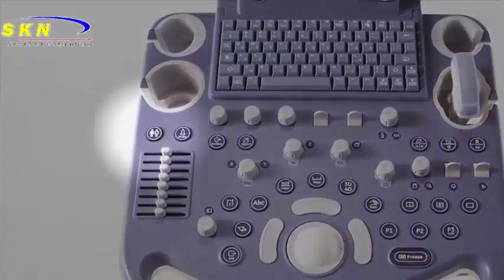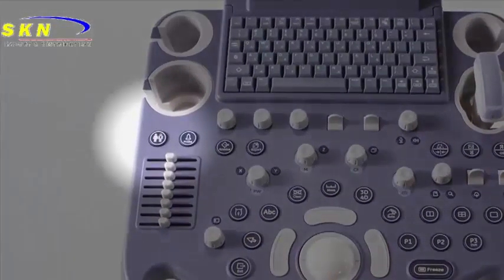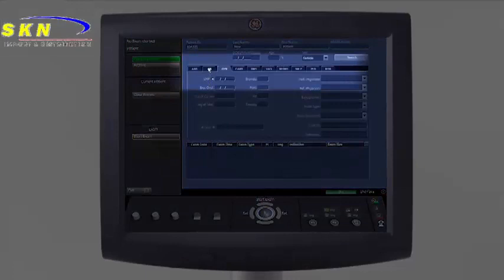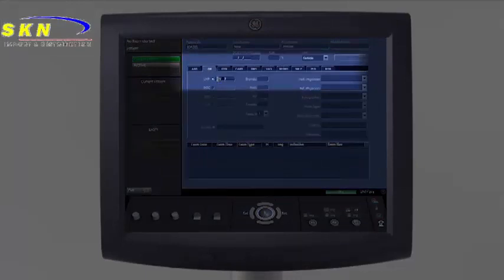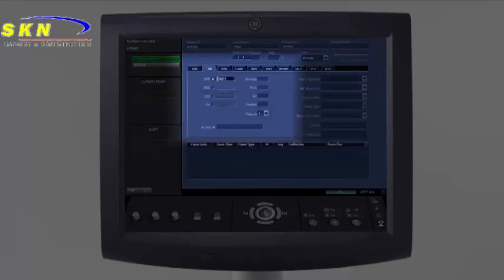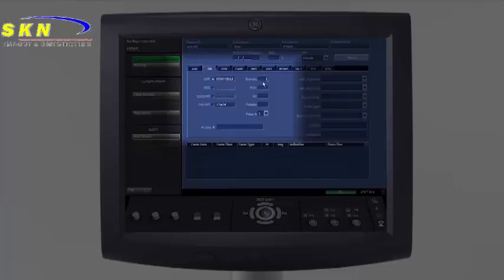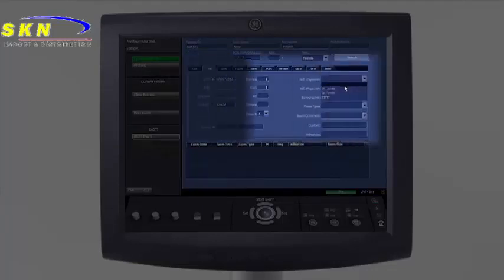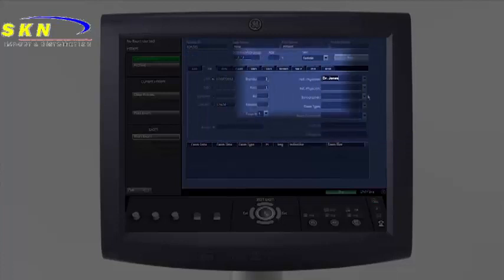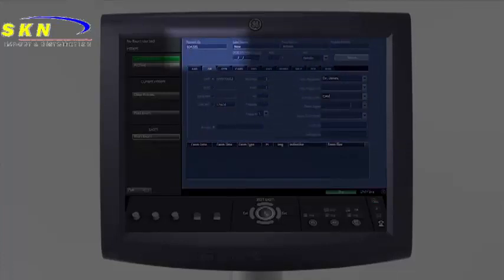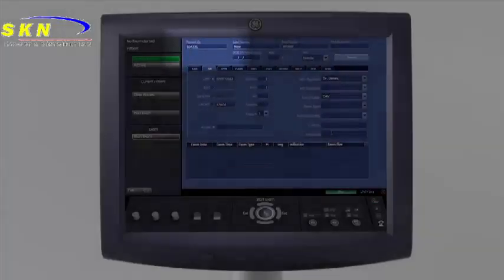Enter patient demographics by selecting the patient key. Tabs across the top indicate the type of exams, and these tabs list input options for parameters specific to each category. For instance, on the OB tab, you may enter all of the OB data including LMP, EDD, multiple pregnancies, etc., as well as physician information. Only patient ID entry is mandatory when storing images.